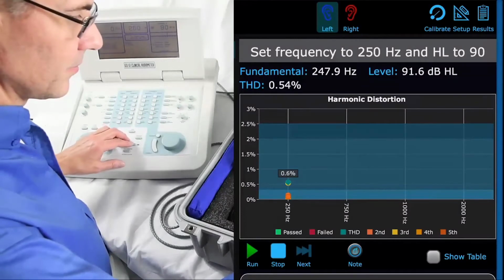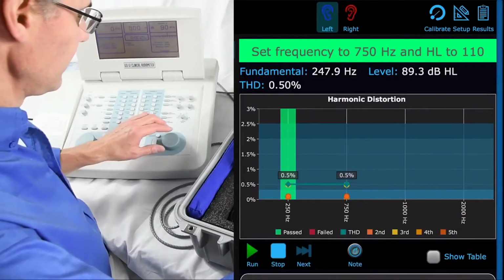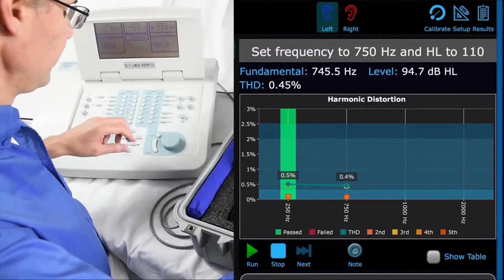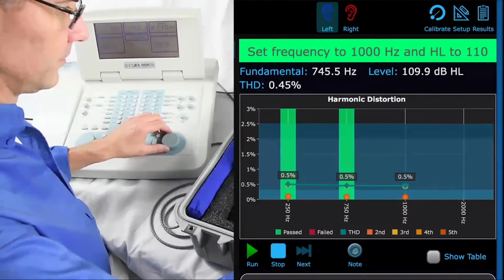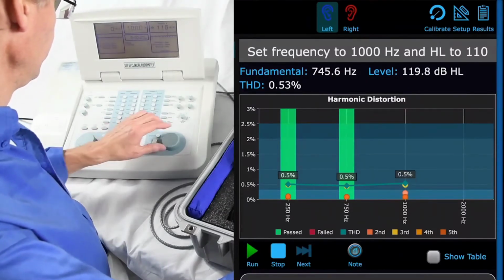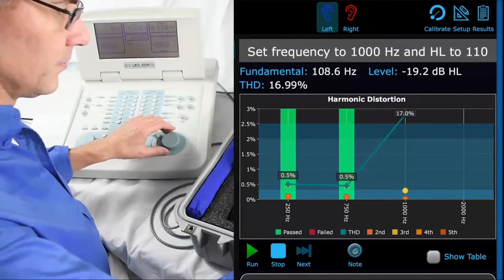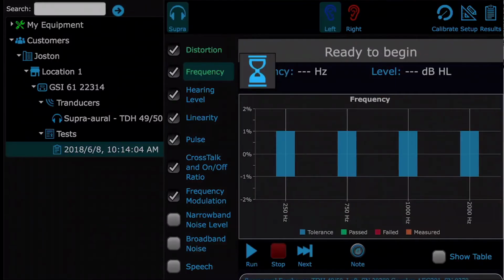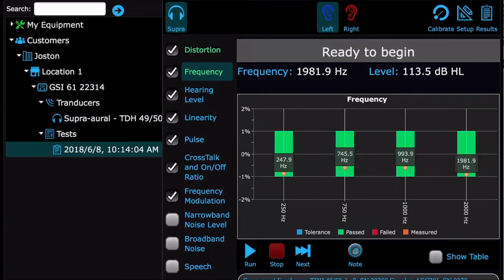As the technician, you only have to follow the instructions in the top gray bar to advance to the next step. When the meter detects the conditions of the step, it will record and move on. You can find the conditions of stability published in the AudCal manual if you want to know more. Distortion and frequency require the same input, so those 2 tests run simultaneously if both selected.